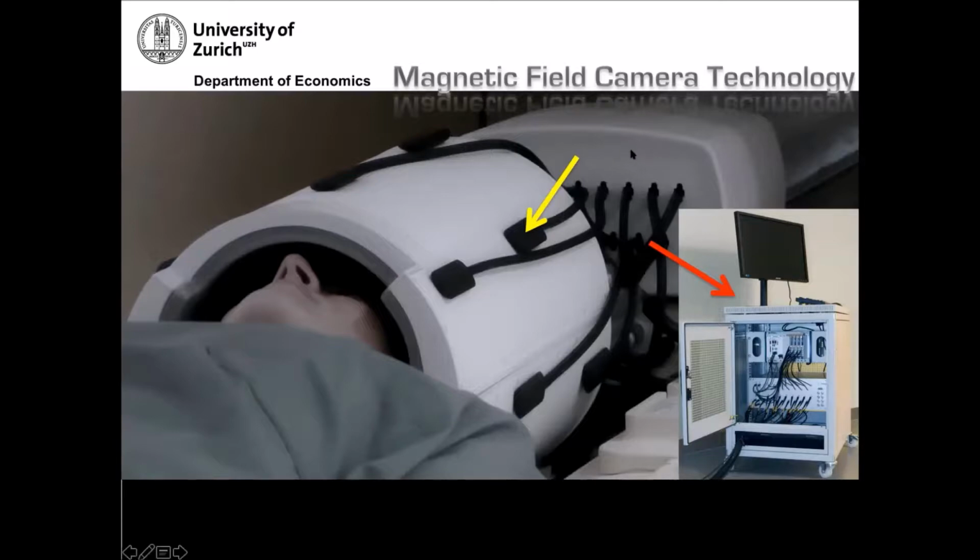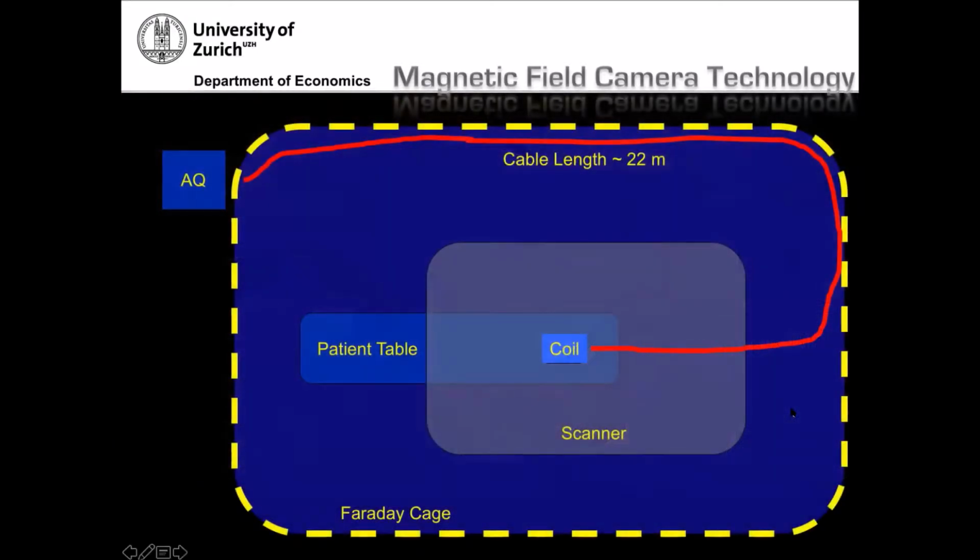In the back here, behind the head coil, you see what is called an RF box, RF front end. As a customer, I don't know much more about it, so I will not say much more about it. But anyway, that's one of the components of the setup. And outside of the scanner room, you will have a spectrometer. This handles the transmit and the receive, as well as the data storage. And from the data that you measure, all the spherical harmonic fitting and display is also done with this acquisition system.